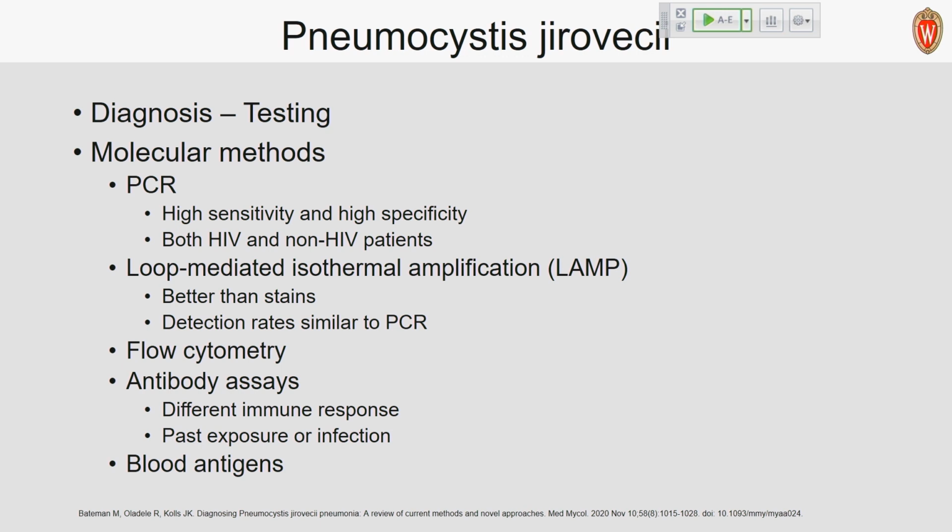Is there anyone that's doing molecular methods for pneumocystis? Everyone is traditional stain. Is anybody doing these stains within their microbiology department as opposed to their pathologist doing them? Microbiology? Okay. Fluorescence, okay.